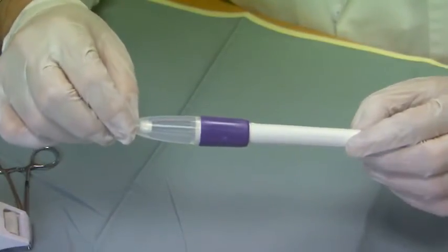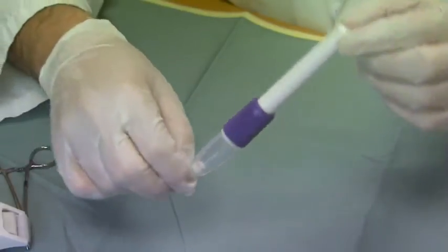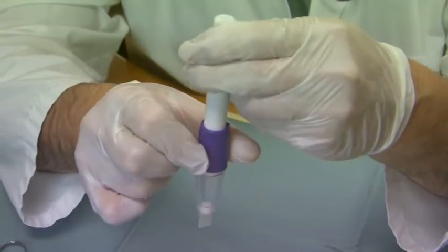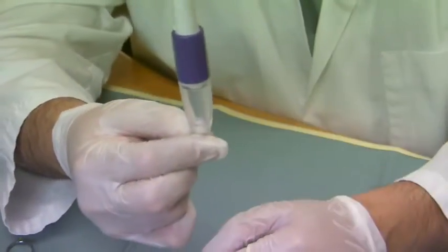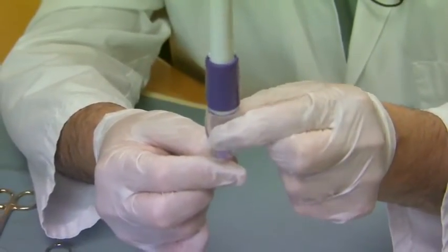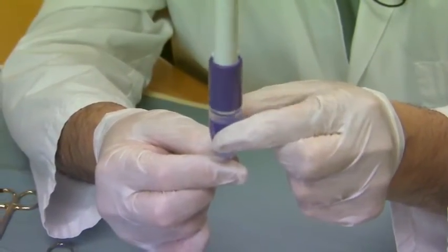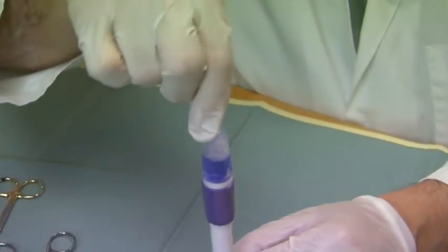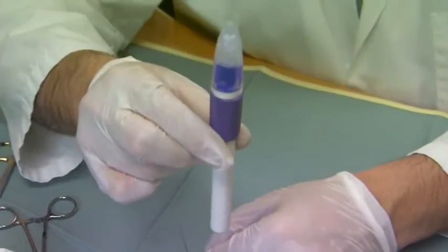To release the adhesive, we invert the pen, twist the purple collar in order to release the material, pinch the tip of the applicator, and then gently squeeze the bulb to draw the adhesive into the bulb. Then turn the applicator over and we're ready to apply it.